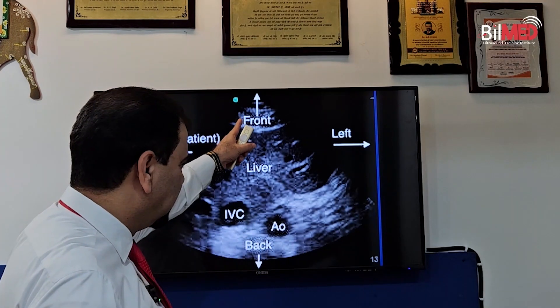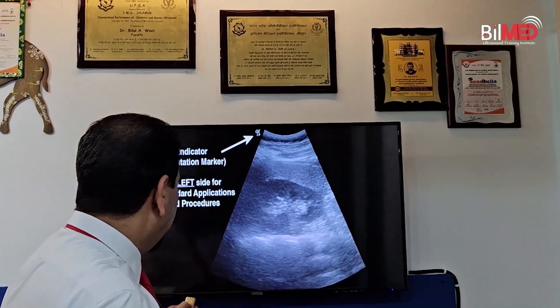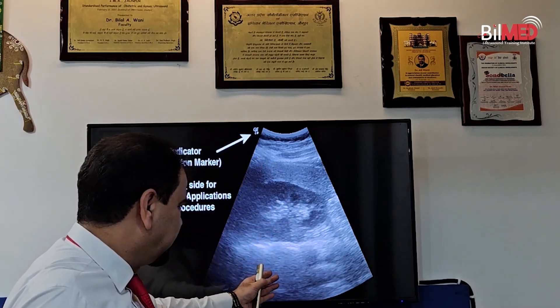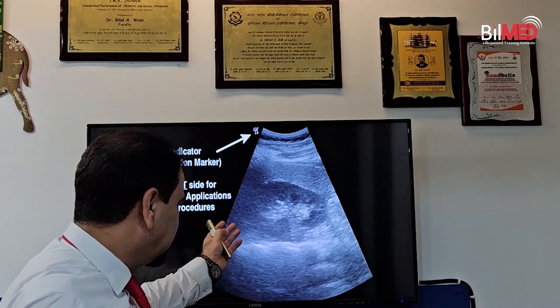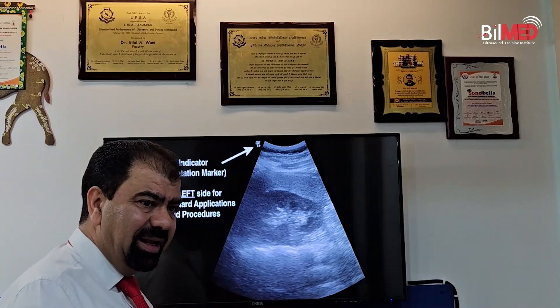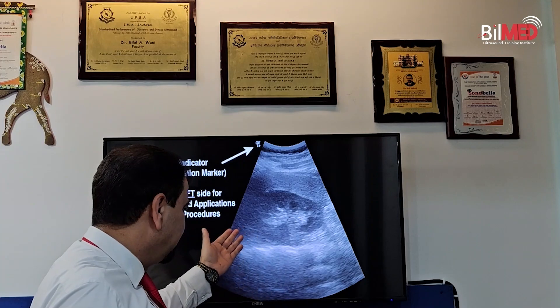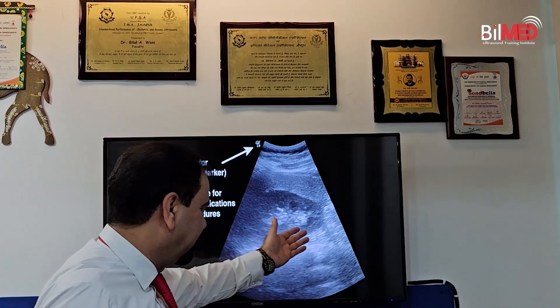In screen orientation, you have to see whether you are in longitudinal section or in transverse section, because there is a difference in screen orientation between the two. In longitudinal section: anterior, posterior, superior, and inferior. But if you are in transverse section, anterior and posterior remain, but superior gets replaced by right, and this side becomes left. So have a clear understanding of screen orientation — only then can you interpret an ultrasound image.